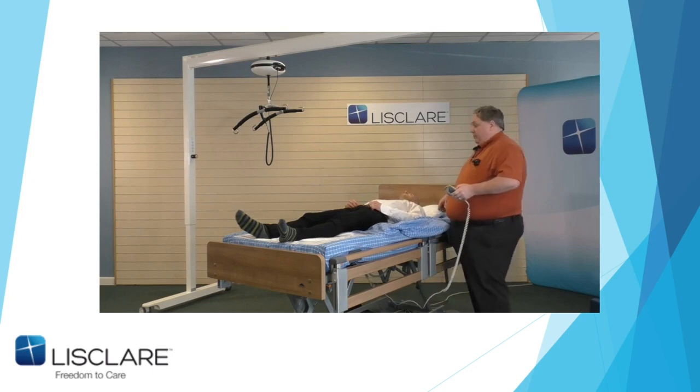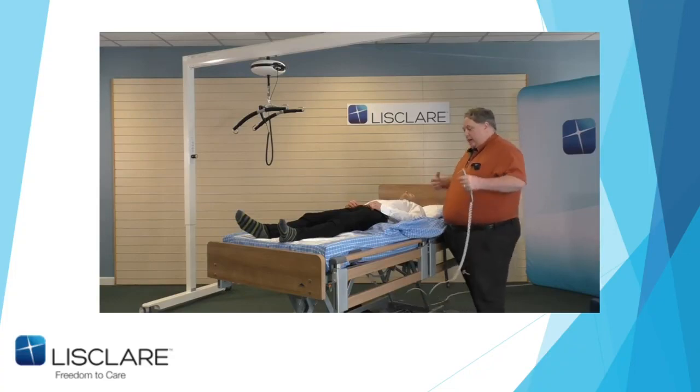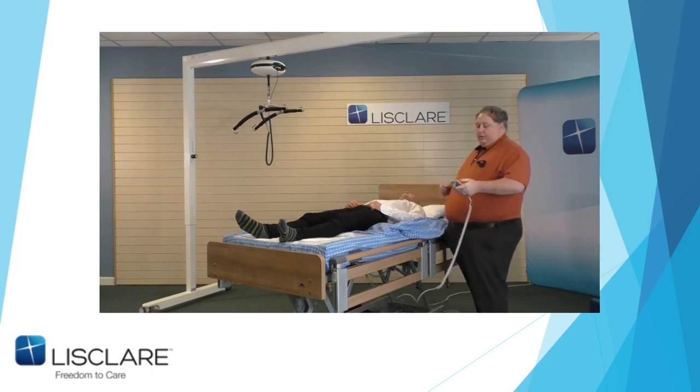So I'm going to show John back up the bed where he is going to be a bit less active. So he can't push up with his left or right leg, and he can't reach out behind him. And again, if there was a team of two carers, it would be slide sheets and ready, steady, slide. But again, because of this demonstration, I'm on my own. All I'm going to do is lift the legs up.